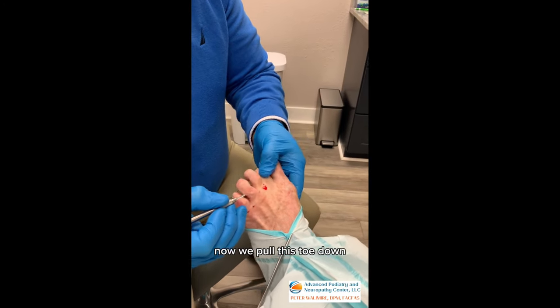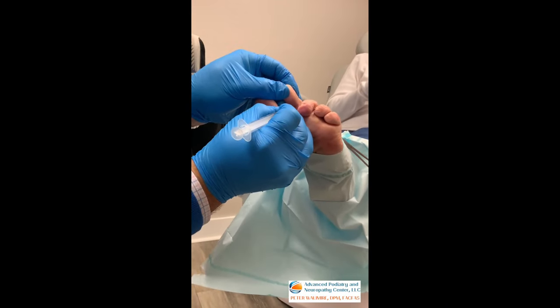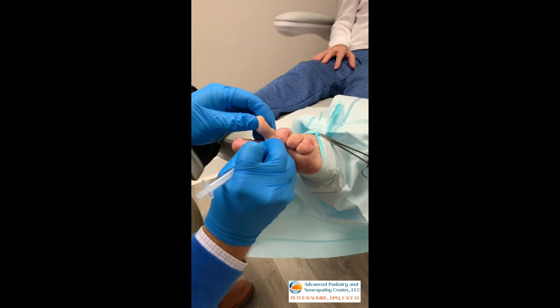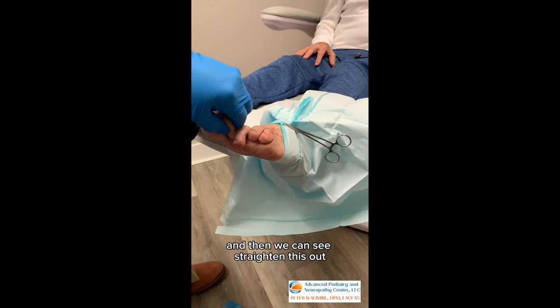Let me pull this toe down. We're going to use an 18-gauge needle and we're going to find this joint right down here. We don't have to go crazy — all we have to do is get a little bit better than it was before. And then we can see, straighten this out.